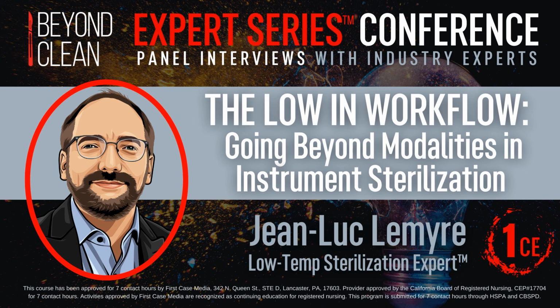After that phase, there are a few differences with sterilizers on the market. Some use plasma. There's another that uses ozone. These two things would help reduce residual peroxide at the end of the cycle. Ozone, if it's used, adds additional lethality. But regardless of whether one or the other is used, after the injection and some exposure time, we gotta let peroxide some time to sit there and do its job.